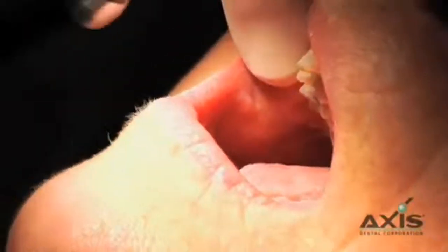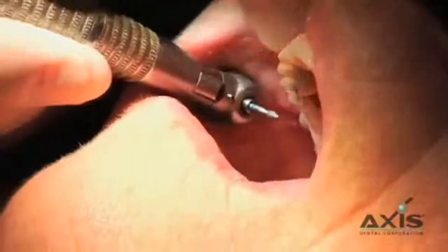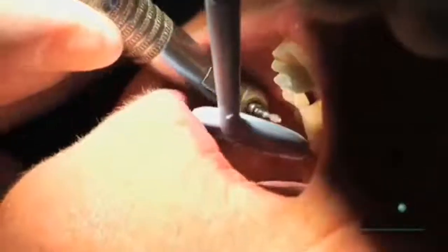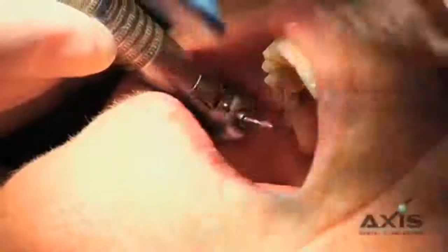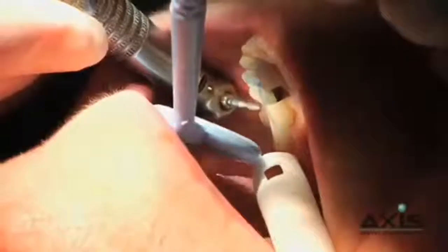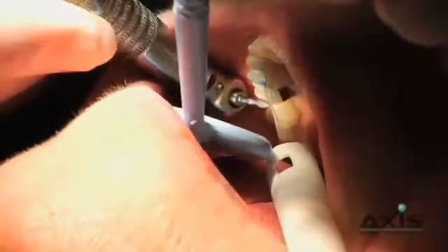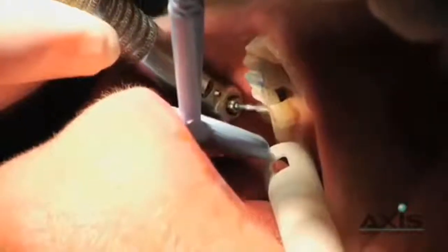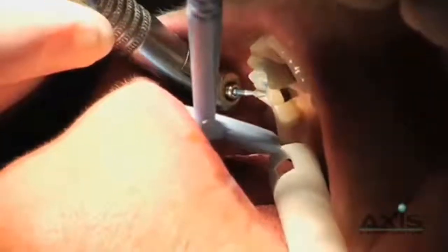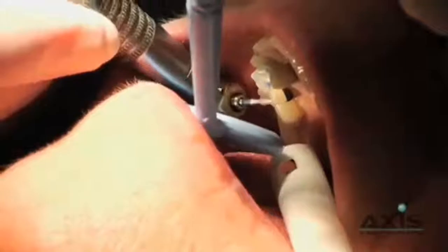So what we're going to do is go in here and begin our adjustment. One thing I do not want to do is create iatrogenic wear facets — just flat planes in these restorations. As I'm doing the adjustments, I'm looking at the spots where I want to keep the blue spot contact. Around that area I'll use circular movements so that we maintain the occlusal anatomy. Instead of creating a flat plane, we'll create a little groove behind the blue line, accentuate the groove in front of the blue line, and then carry the diamond burr — the Zurcut — in a circular motion to maintain the natural tooth anatomy. On this mesial marginal ridge, same thing: keep the diamond moving in a circular motion so we don't create just a flat plane.